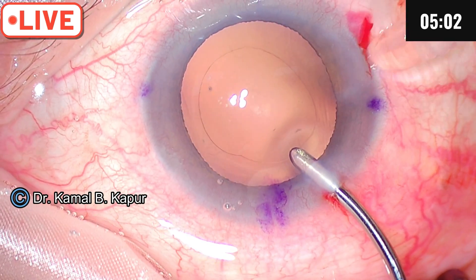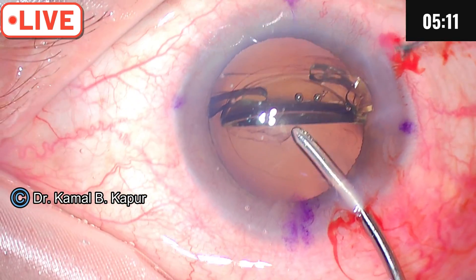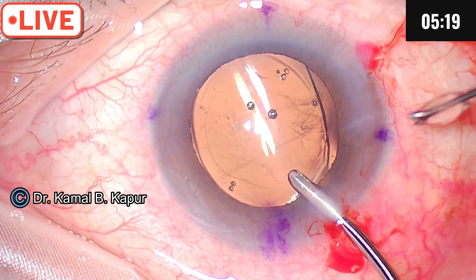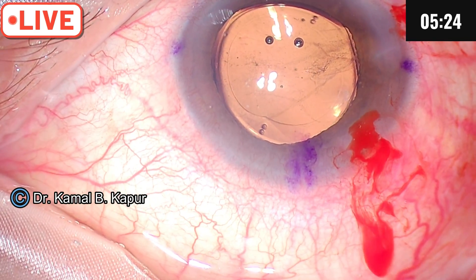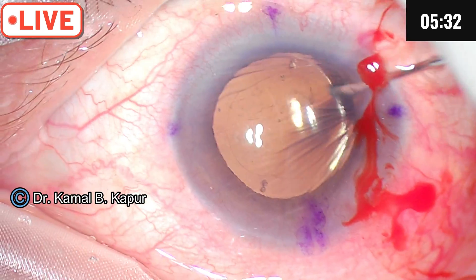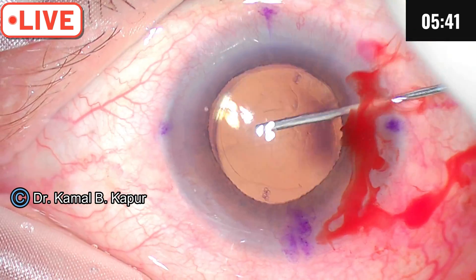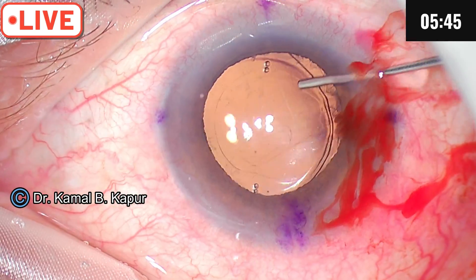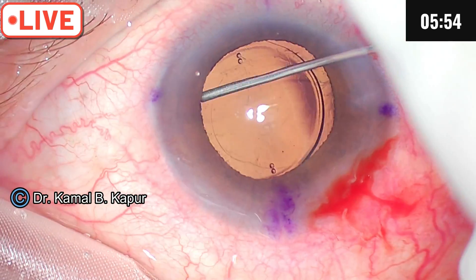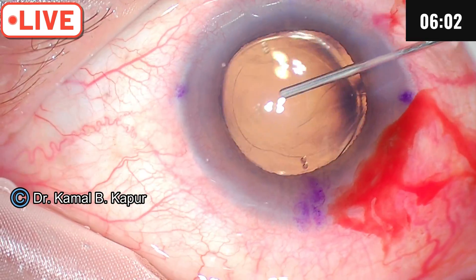You will notice that we under-rotate the lens — we need to place it at 95 degrees, so we'll probably leave it at around 80 degrees to start with. Before the IOL opens fully, under-rotate it, giving enough time to wash the viscoelastic and clean. Then go behind the IOL — the posterior surface has been polished and cleaned. All that remains is to rotate the IOL into position. The advantage of under-rotating slightly is that in the final adjustments you can rotate and place the IOL at the desired axis.